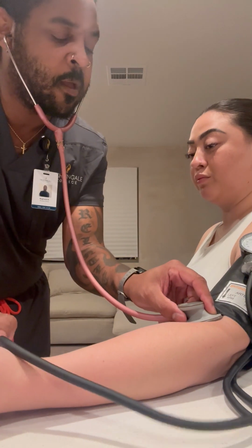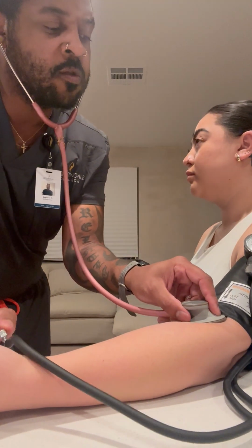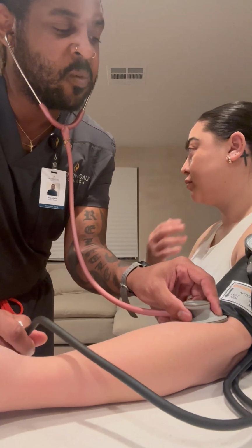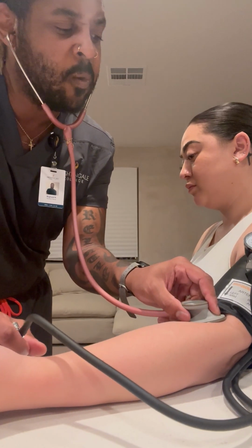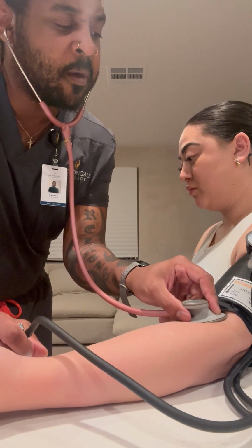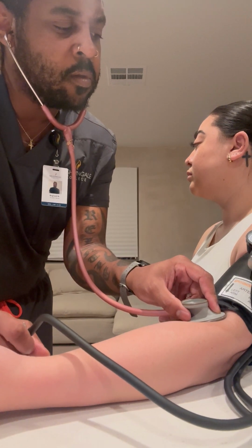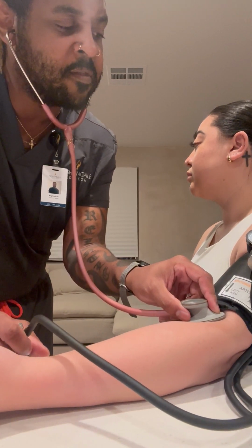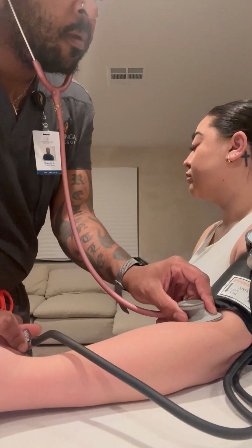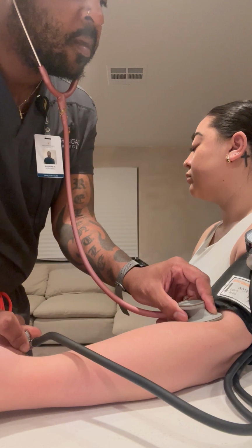Okay, and again, you shared your normal blood pressure is about 120 over 70, right? Yes. Okay. So what I'm going to do is, since her normal blood pressure is 120 over 70, I'm going to pump up the cuff to 160 to make sure that it's 30 above for her systolic. So now that it's there, I'm gonna make sure that I release the air nice and slowly.